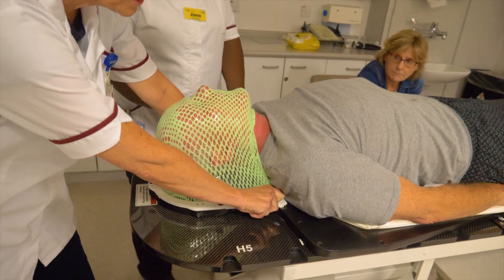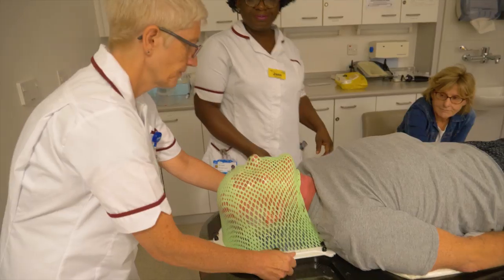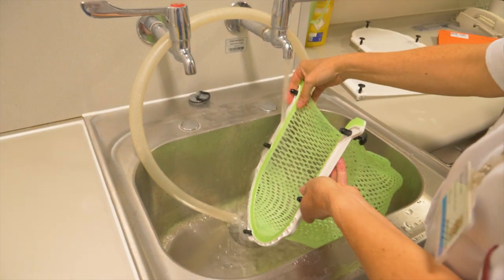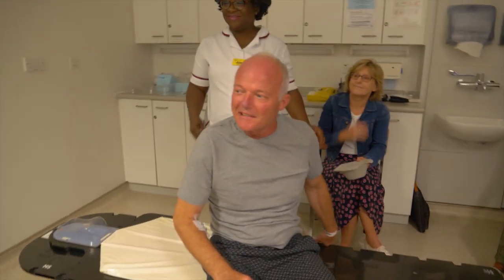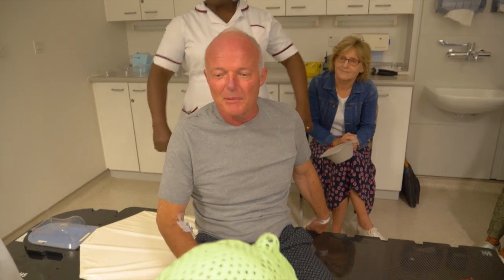If it's tight on your chin, just lower your chin. Once the mask is ready, we can go through towards having a radiotherapy planning scan, which is a specific kind of CT scan. If the patient is well enough, this can happen pretty much straight after the mask has been made.